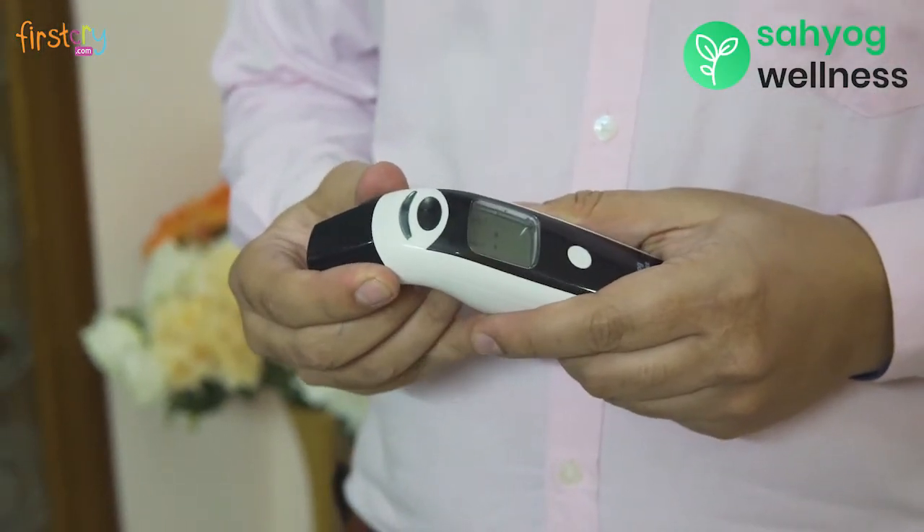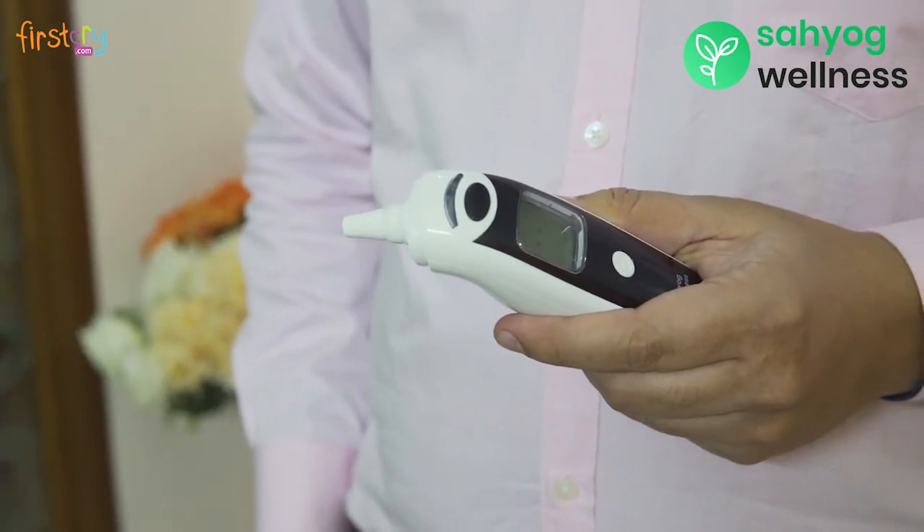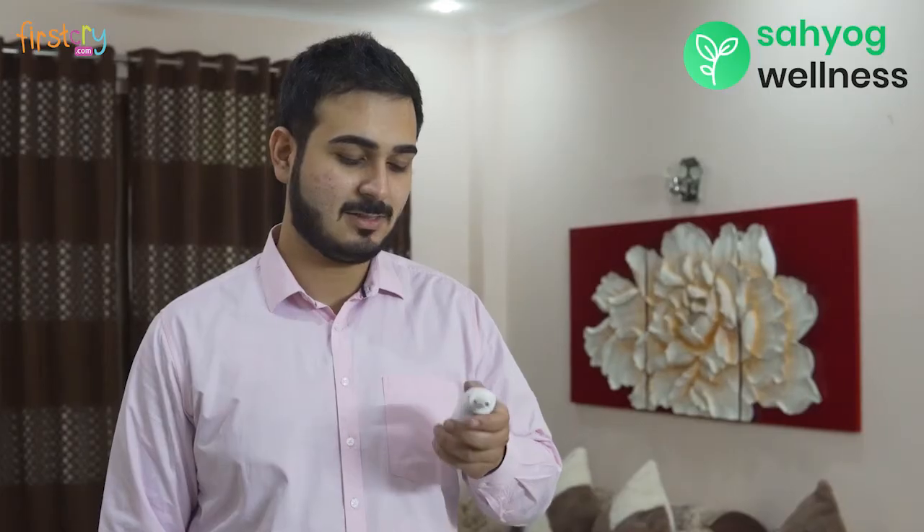To use in ear mode, remove the black cap. The thermometer goes into ear mode and you can see an ear-like image on the screen. Insert the nozzle in the ear canal and press the black button. The temperature will be displayed on the screen.